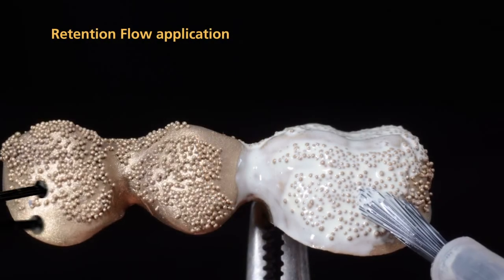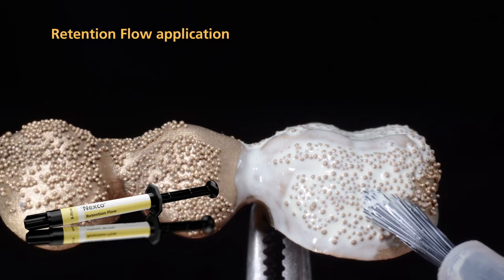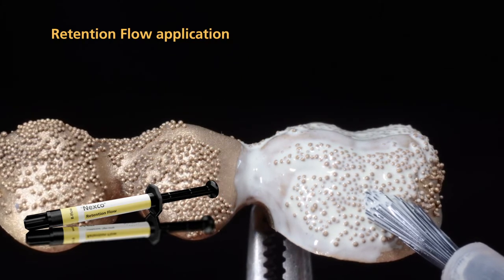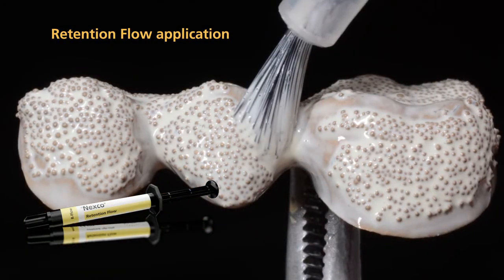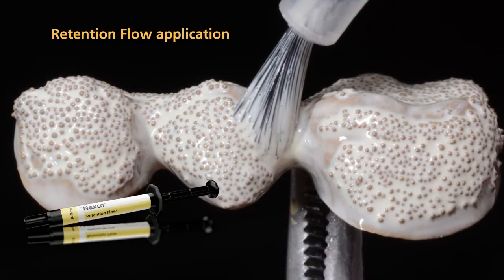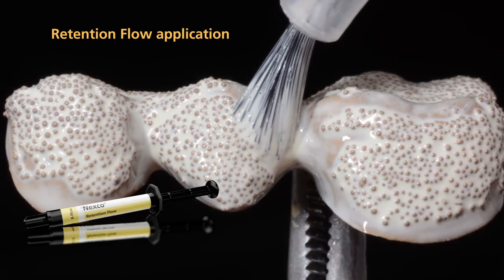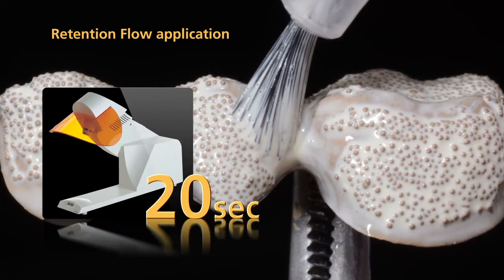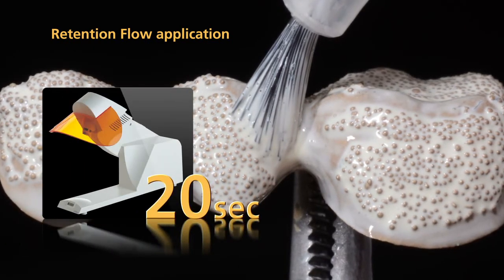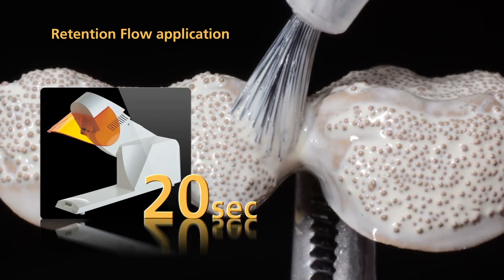The application of SR-NEXCO retention flow is optional. This material easily flows into the spaces under the retention beads due to its low viscosity, which increases the effectiveness of the bond. Apply retention flow to the undercuts of the retention beads with a brush before you apply the first layer of opaquer. After that, light cure retention flow for 20 seconds with a quick pre-curing light.